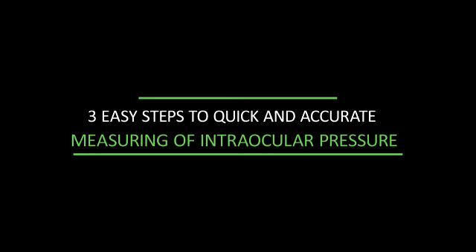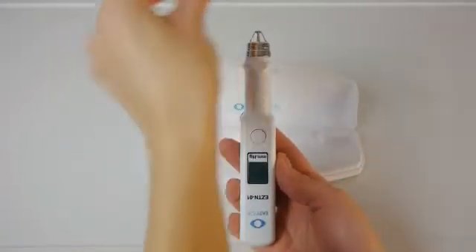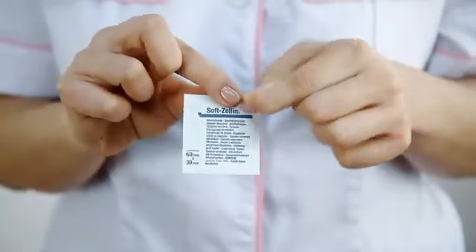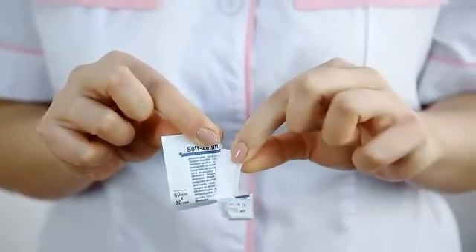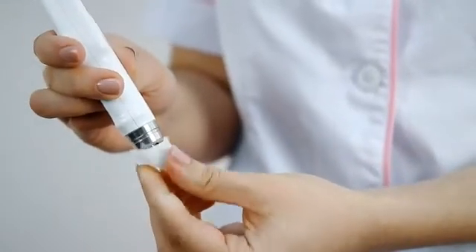It takes 3 easy steps to measure intraocular pressure quickly and accurately. Getting ready for use. First of all, take the protective cap off. Please make sure to disinfect the protective ring and vibrator rod before the first use of the tonometer and before each new patient. Please avoid penetration of disinfectant inside the device.